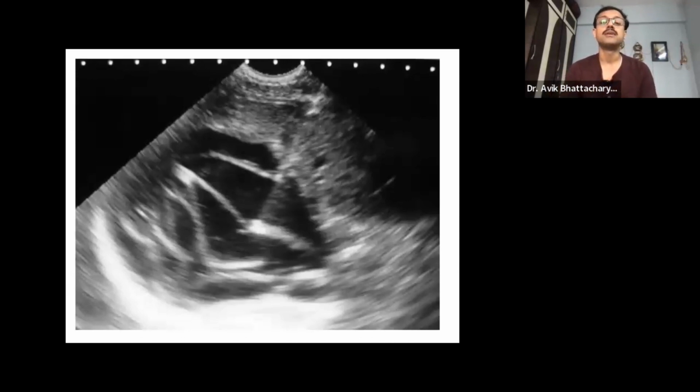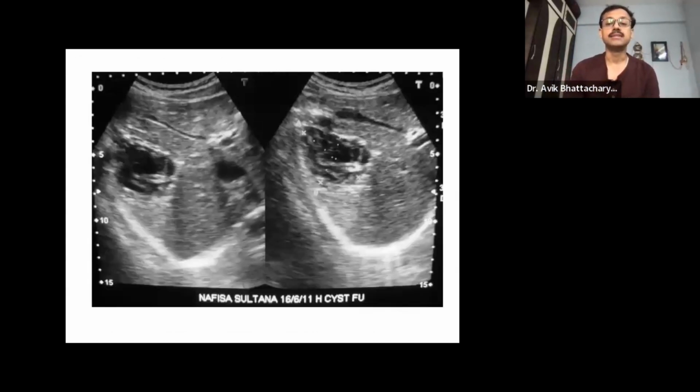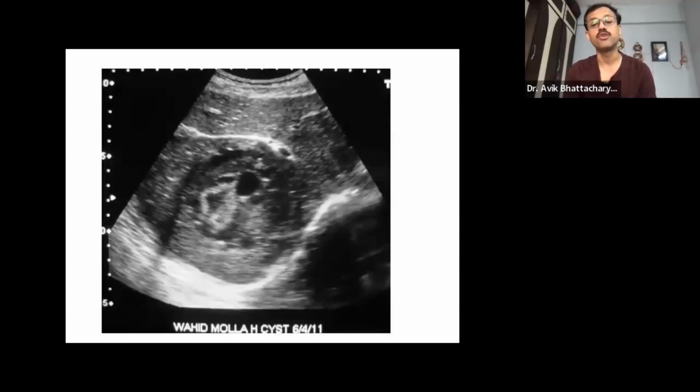Here we punctured the cyst with a needle. We could see a straight linear echogenic lesion. The tip is bright, giving artifact. This is a needle. We hit the cyst and we aspirated the fluid. We injected sclerosant and re-aspirated. The procedure is called PAIR. And this is the follow-up scan showing the hepatic hydatid cyst much smaller in size. Although we could see some curvilinear membrane still inside, the lesion becomes smaller. We followed it up.